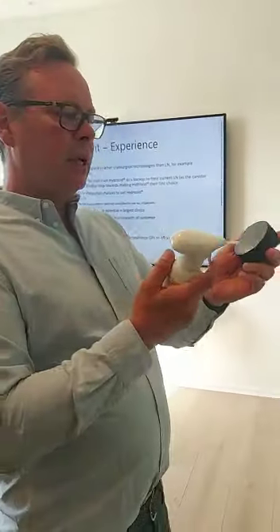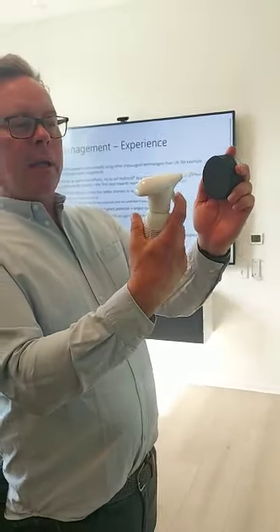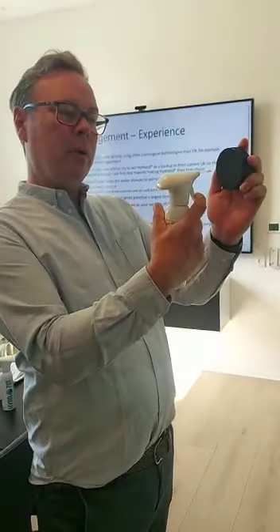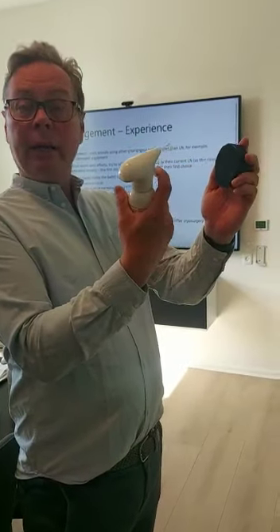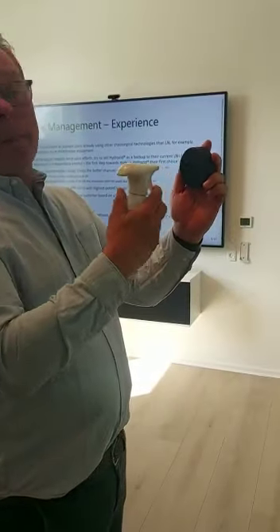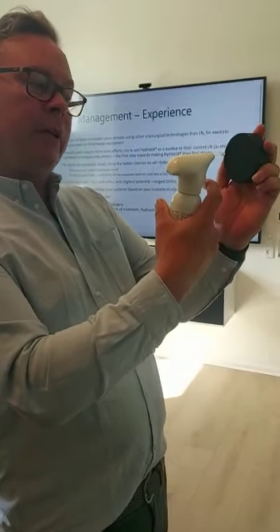Number one: when you push the trigger, it's important that you hold a little farther down on the trigger. I can best control it with one finger. Some people do best with two fingers, but I can best control it with one finger.